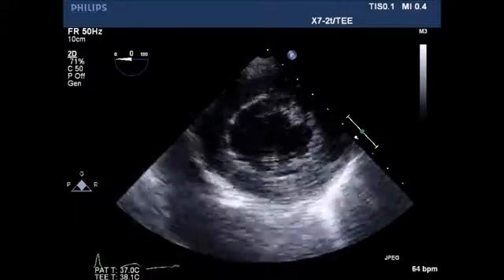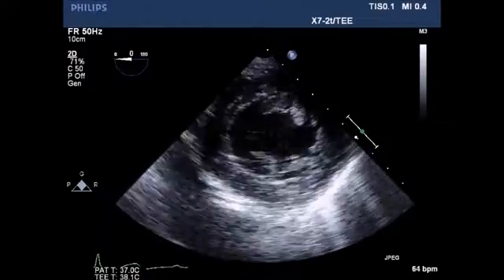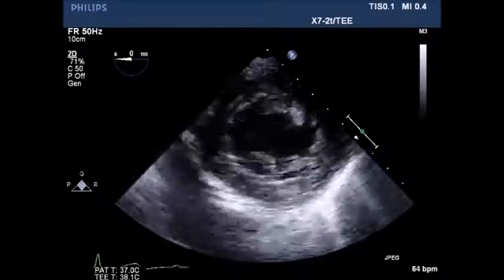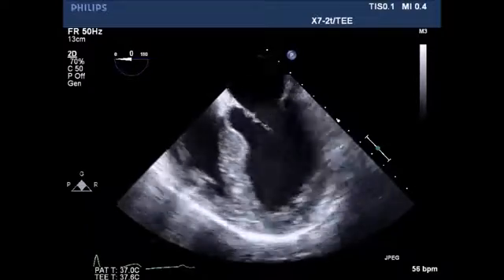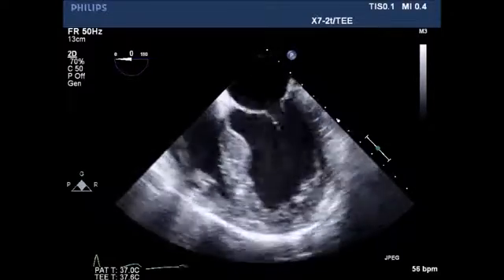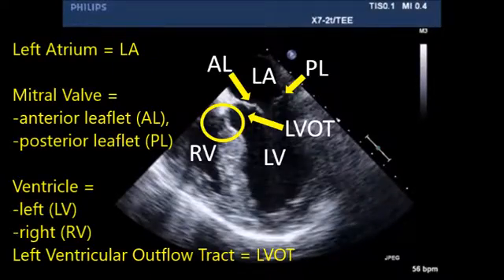Transgastric view of the left ventricle with normal function and some left ventricular hypertrophy noted. Four-chamber view, with systolic anterior motion of the mitral valve noted.